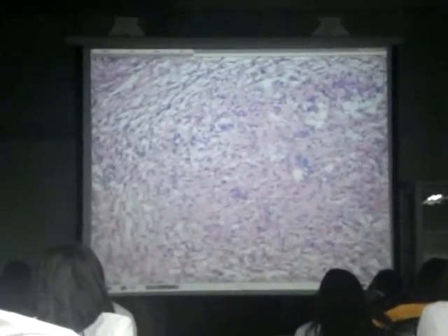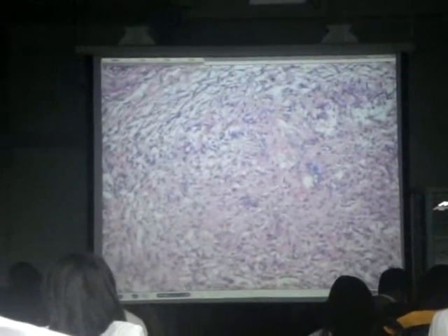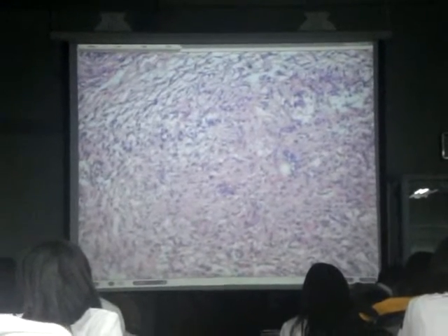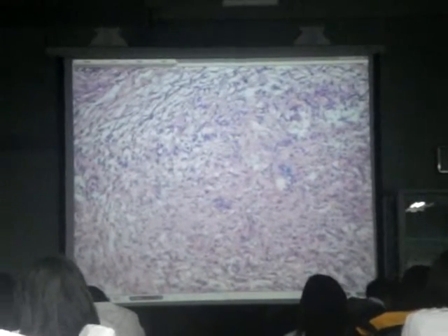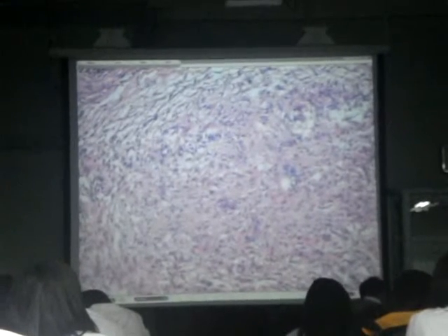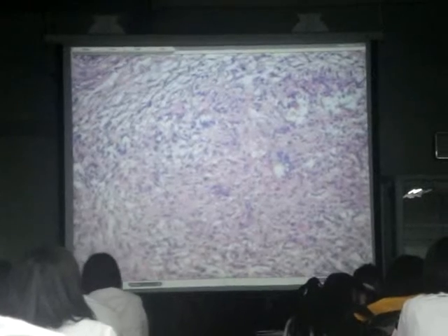Caseation necrosis is always associated with granuloma formation. So, in the practical examination, if you see necrotic debris and you identify the epithelioid histiocytes composing the granuloma, think of it as caseation necrosis. Do not think of liquefaction necrosis anymore. Okay?